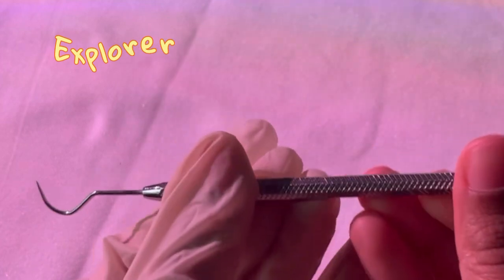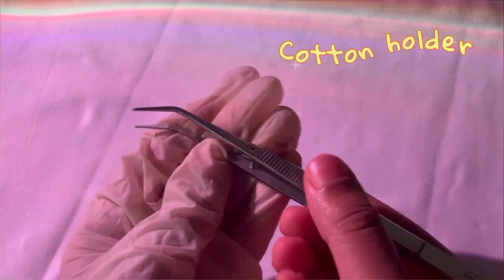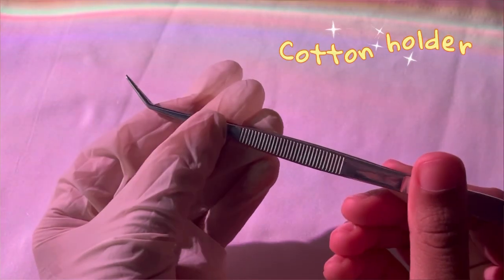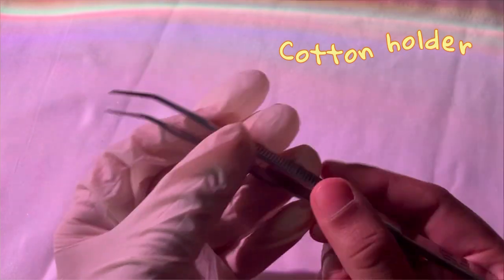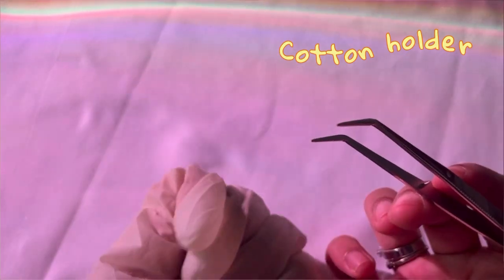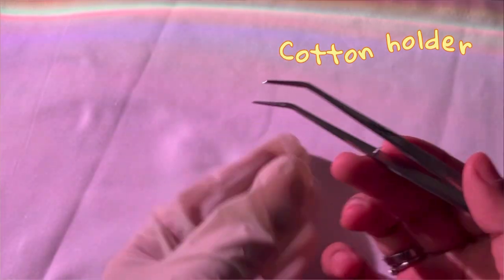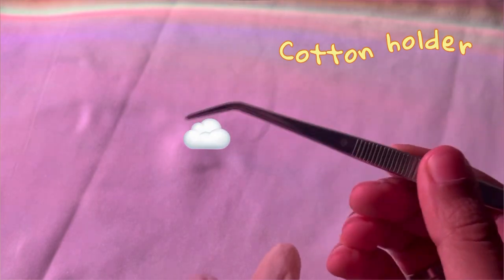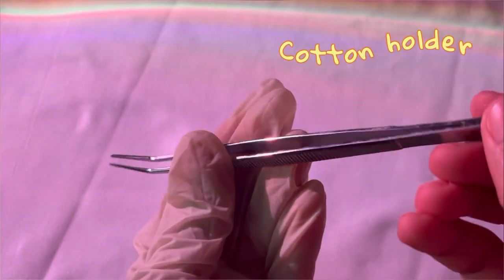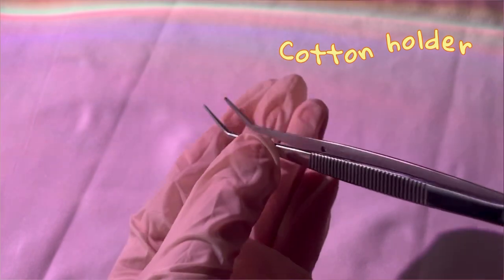These are nothing but tweezers or cotton holders. You use them when your hands or gloves are really dirty and you can't open your drawers to pick something like cotton — you just use these instead. They are normal tweezers, also known as cotton holders.